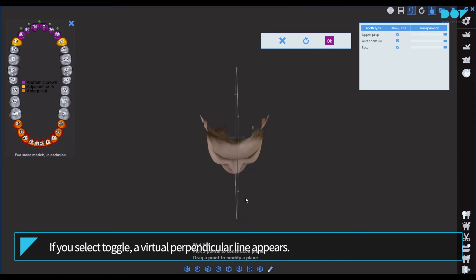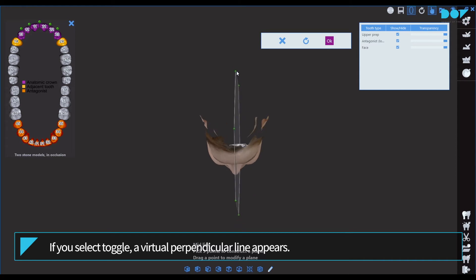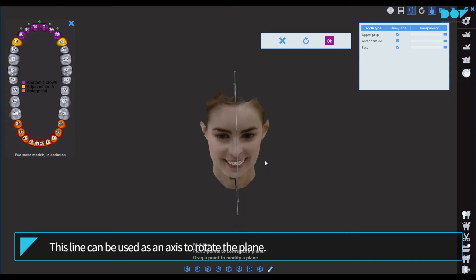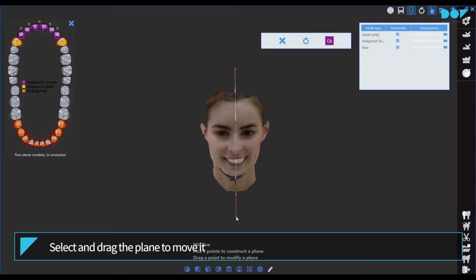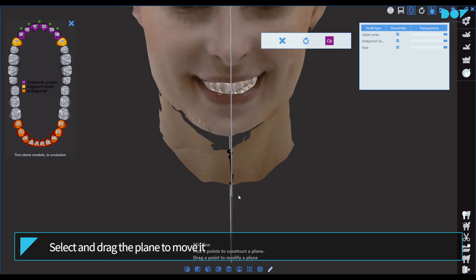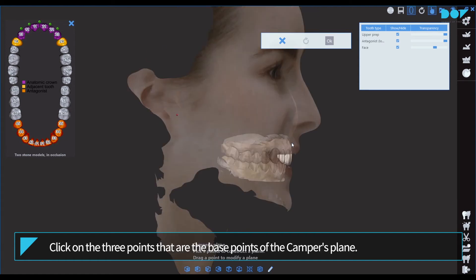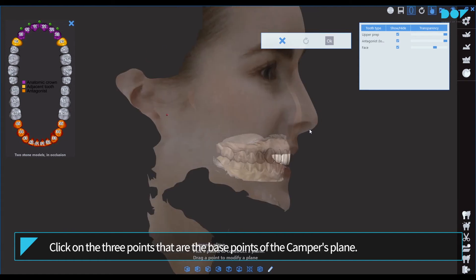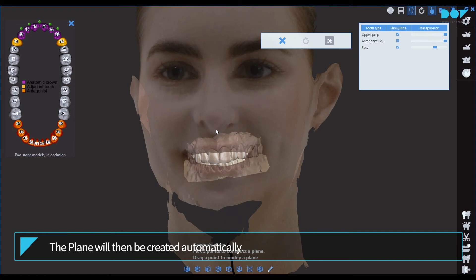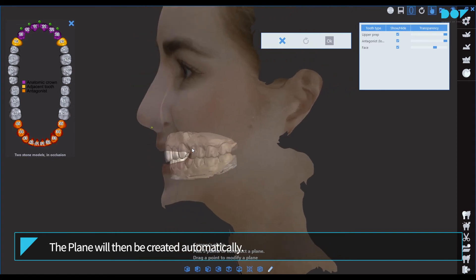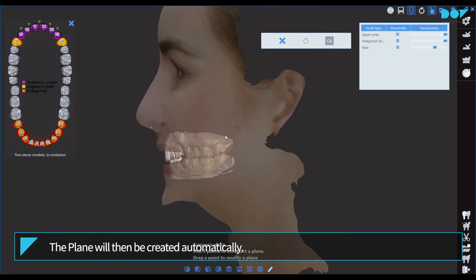The created plane can be rotated and moved. If you select toggle, a virtual perpendicular line appears. This line can be used as an axis to rotate the plane. Select and drag the plane to move it. Click on the three points that are the base points of the Camper's plane. The plane will then be created automatically.